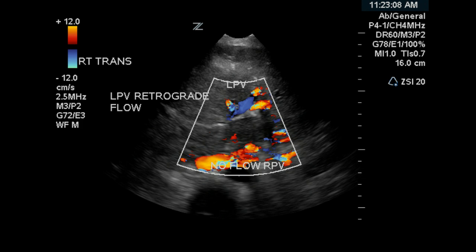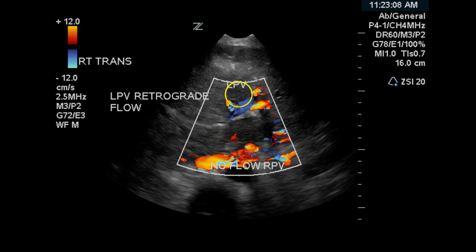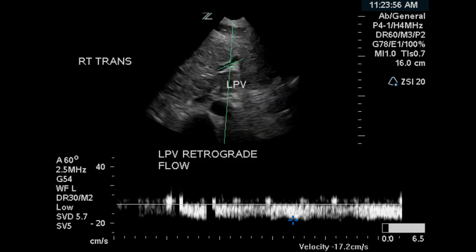This color Doppler image shows that the left portal vein has flow going toward the bottom of the screen — that's why it's blue. This is a flow that is going out of the liver, either retrograde or hepatofugal. This pulse Doppler demonstrates reversed flow in the left portal vein, and the flow is continuous.